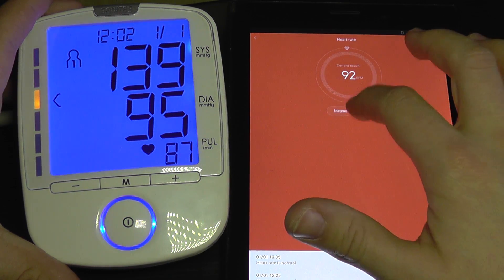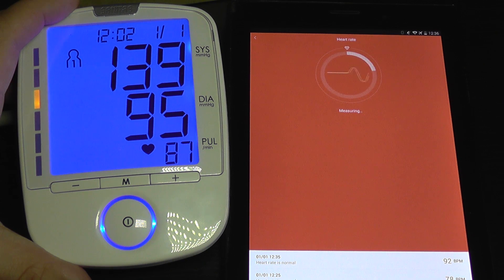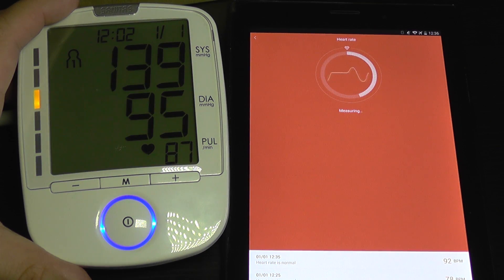I'm going to test again with the band. Now it's 77.